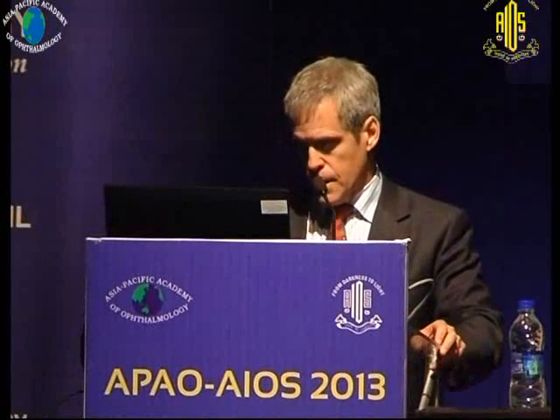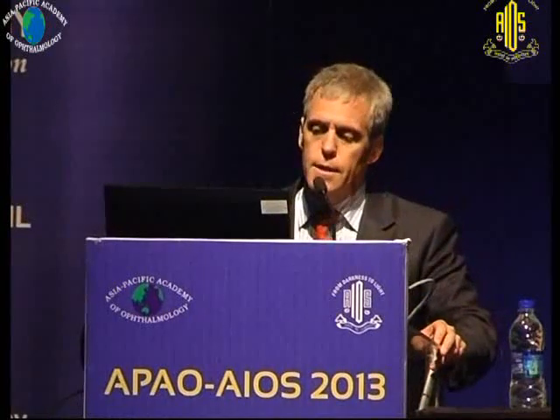And in trauma cases, we may need to deal with iridodialysis, dilated pupil, or loss of iris. You have to decide what approach. In this case, it's a Marfan's patient with a dense nuclear sclerosis. I decided that it was too dislocated or too subluxed to allow tension rings, and too thick to use 23 gauge. So I've used a fragmatome there.